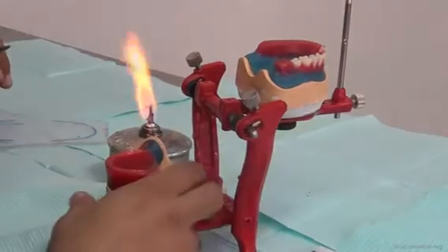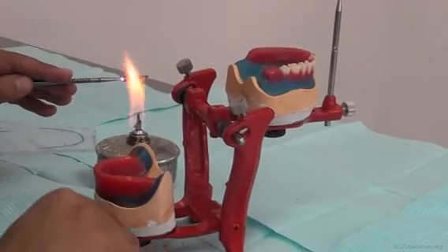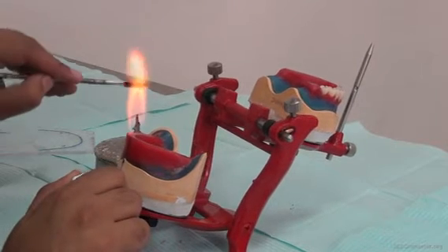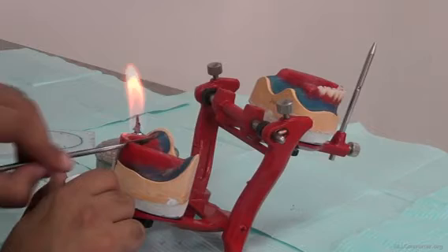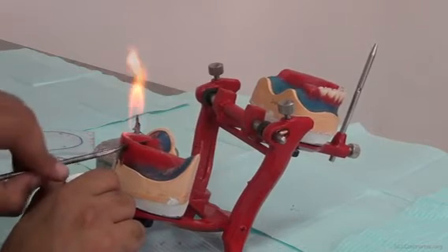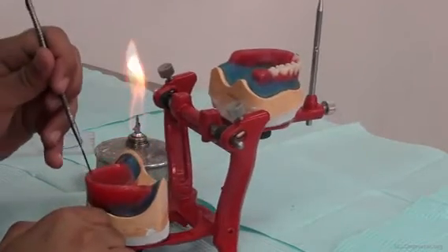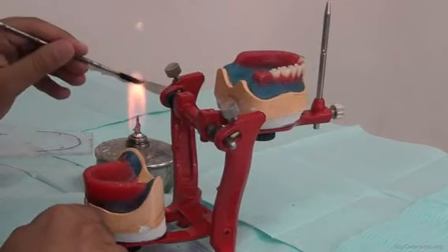For adding the teeth, we're going to follow the same rule as we did in the upper, where we are opening boxes. For each tooth, we're going to open a box. We're going to open around the midline, mesial to the midline. And as we said in the upper, please set two central incisors together to make sure that we observe or preserve the midline.